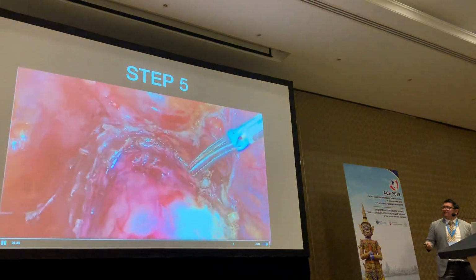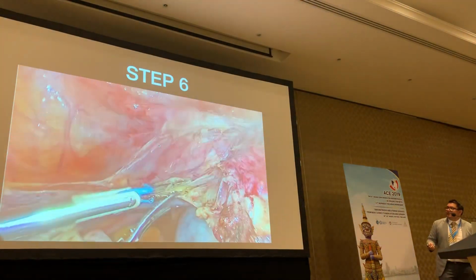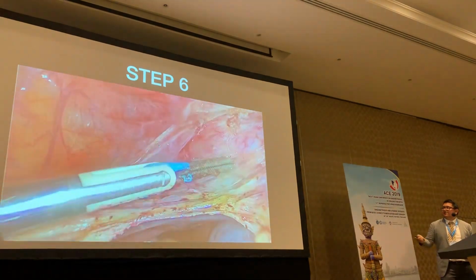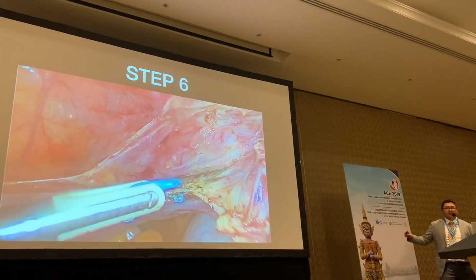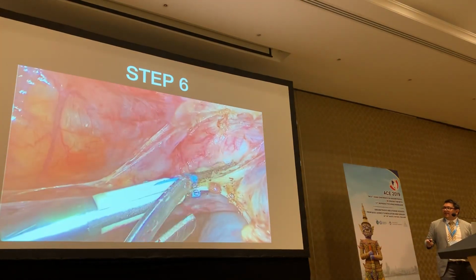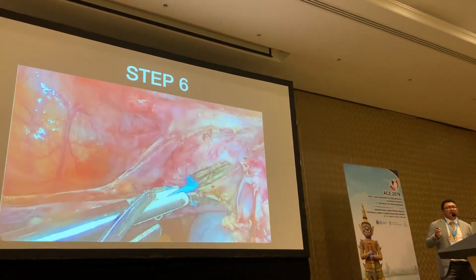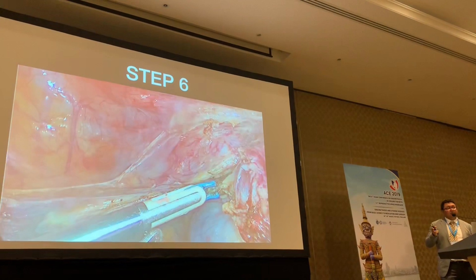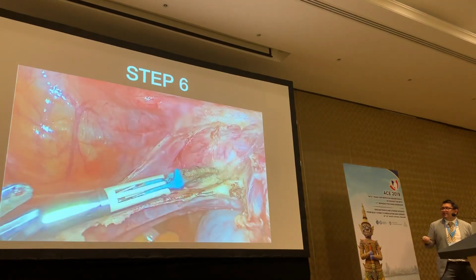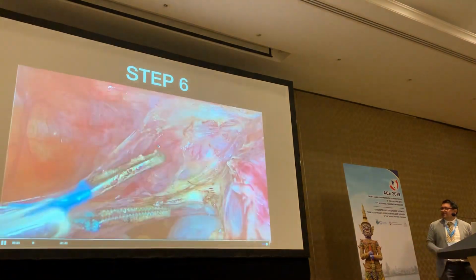So you push all those fibers down till you're comfortable, and then you're ready to take your uterines off. There's no need to skeletonize the uterine, but you have to take it in a couple of sections, lining the wall of the uterus, and again, selectively cut very slowly. If you cut slowly and you see blood announcing itself, immediately you come in with your bipolar, and you can see the uterine there and the tortuosity of the vessel below.